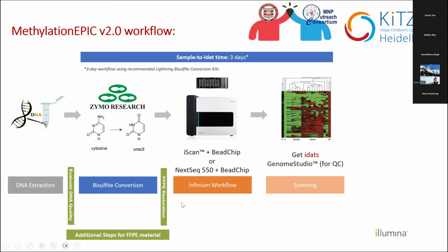And this makes the duration a bit longer of the workflow. And before we proceed further, I would like to stop a bit and highlight that there are 2 different platforms conducting methylation scanning at the moment from Illumina.